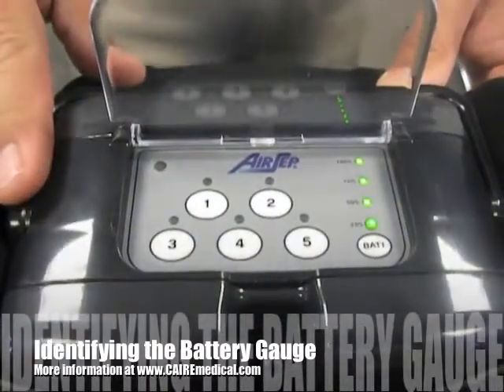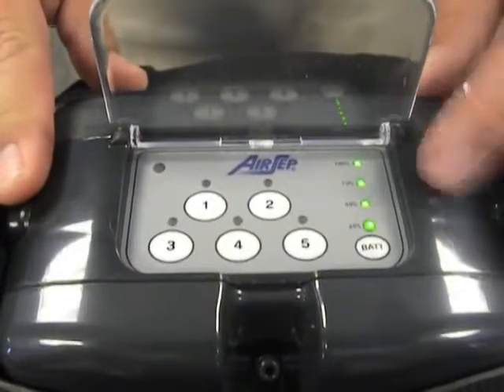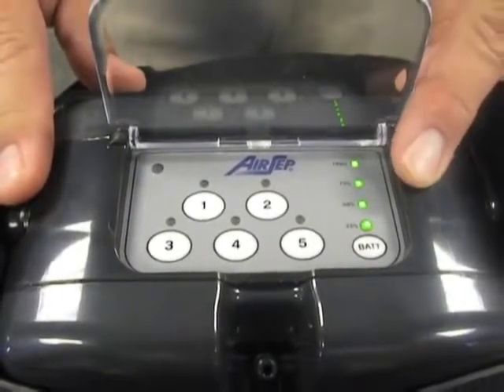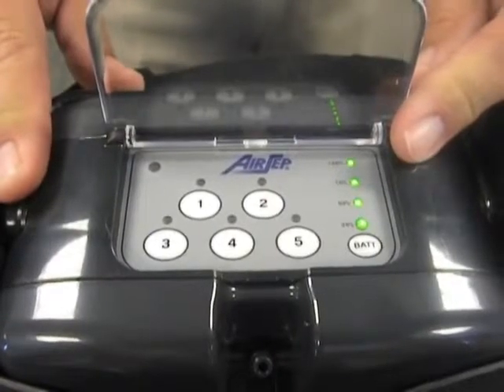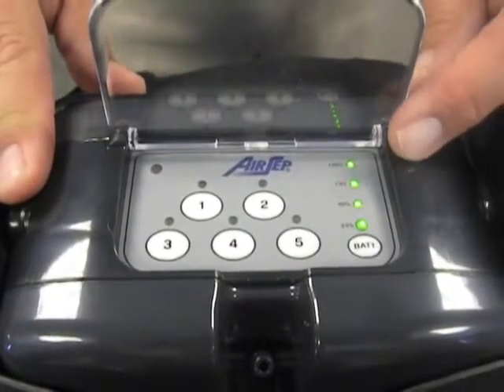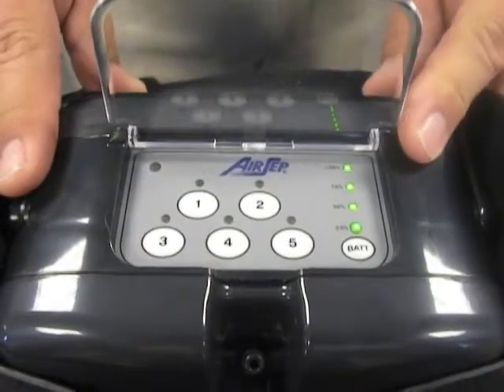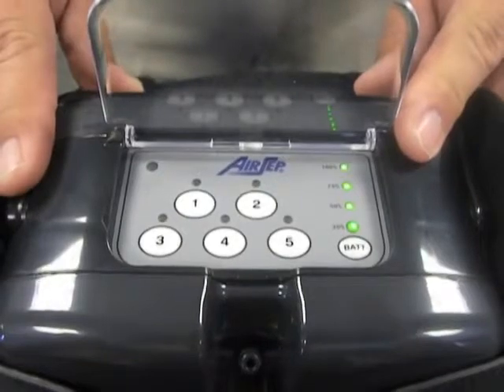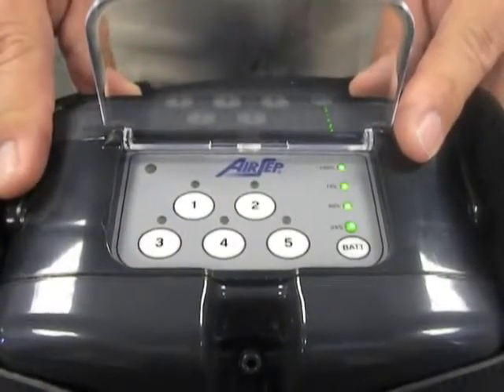Reviewing the control panel of the FreeStyle 5, you can see that currently the battery is in charge mode. The battery at this point is approximately 75% charged with 100% light blinking. Those lights will continue to blink until the battery is fully charged. Once the battery is charged, the lights will shut off after a couple of minutes. This indicates that the battery is fully charged and ready for patient use.